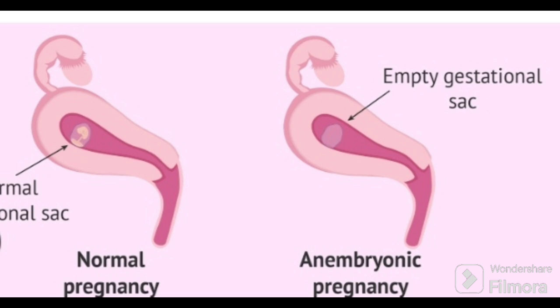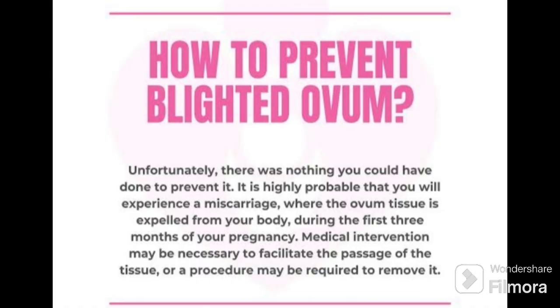There is no fetal pole and no cardiac activity, so this is called blighted ovum. In short, we say that pregnancy has occurred but there is no growth, no cardiac activity, no fetal pole, and no development.